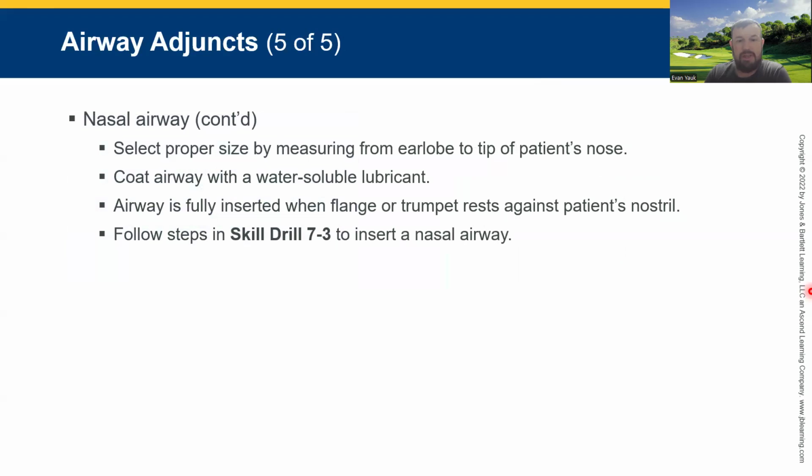So the proper size for these is earlobe to the patient's nose. So oral airway was mouth to earlobe. Okay. This is a nasal airway. So it's nose to earlobe. Pretty self-explanatory right there. Coat the airway with some water soluble lubricant.